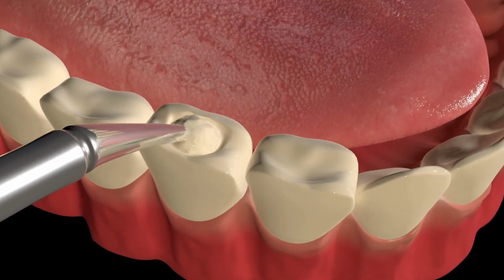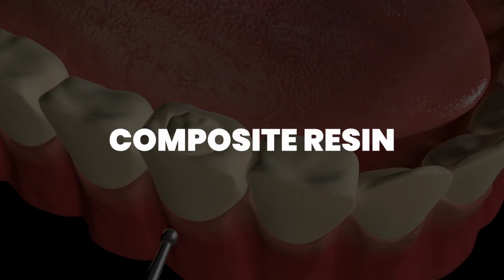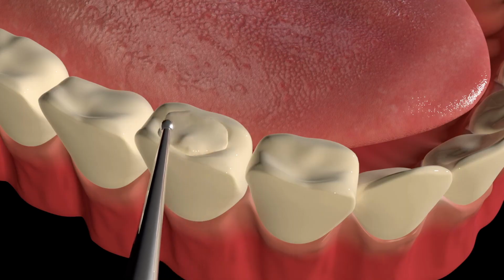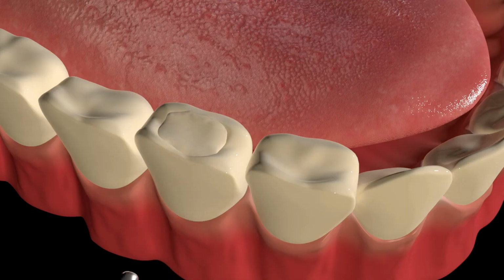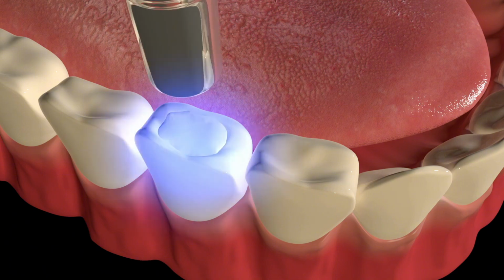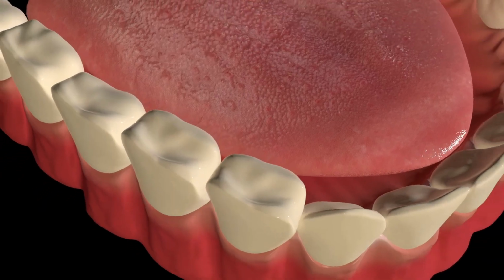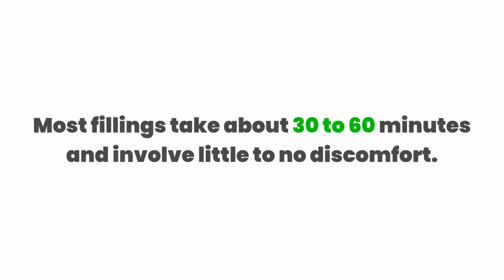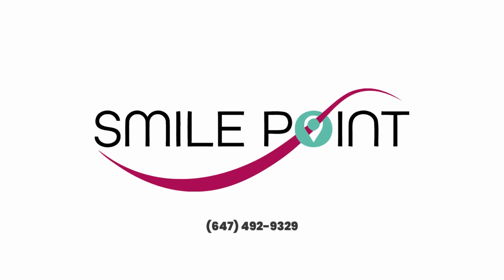Several filling materials are available, including composite resin, amalgam, and ceramic. Your dentist will recommend the best option based on the location and size of the cavity. The filling is placed, shaped, and polished to restore the tooth's natural function and appearance. Most fillings take about 30 to 60 minutes and involve little to no discomfort. Preventing cavities through good oral hygiene and regular dental checkups is the best way to protect your smile.